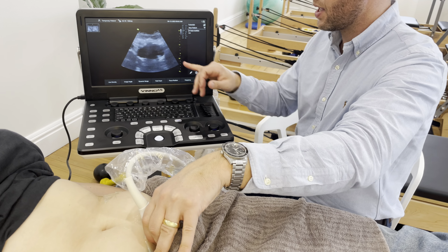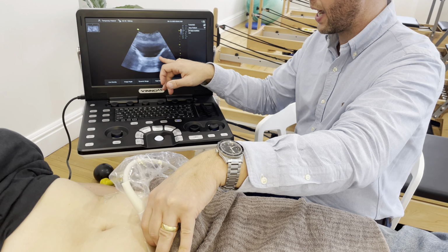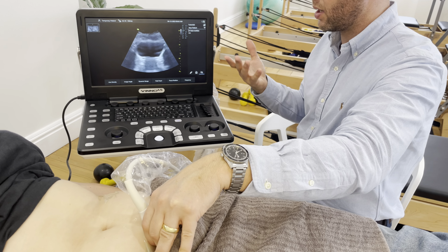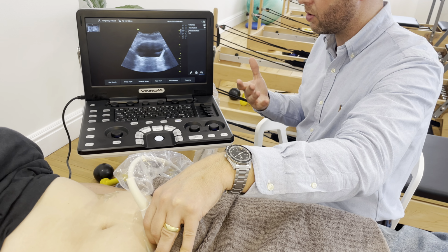So probe position just above the pubic bones like this, and then angling down in this direction until we find the bladder. So the bladder is going to be this dark hypo or anechoic structure here, and the base of the bladder is going to be this hyperechoic white line down here.